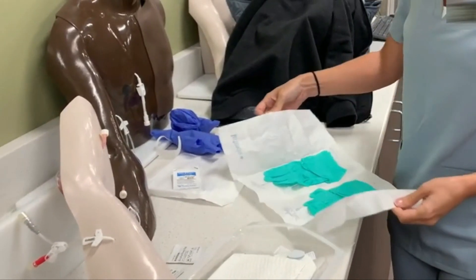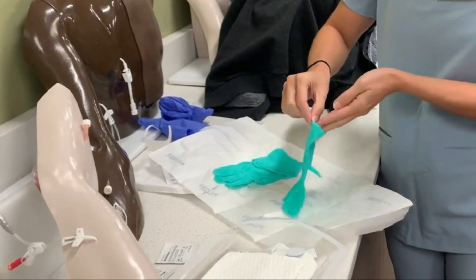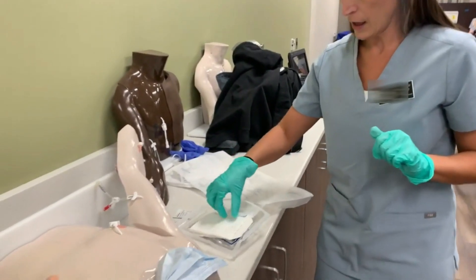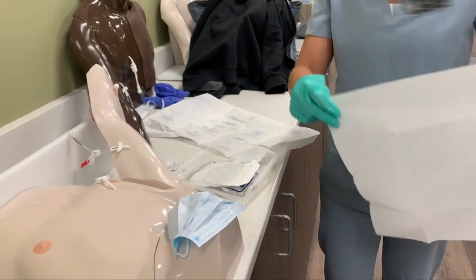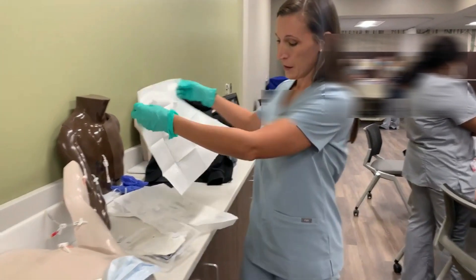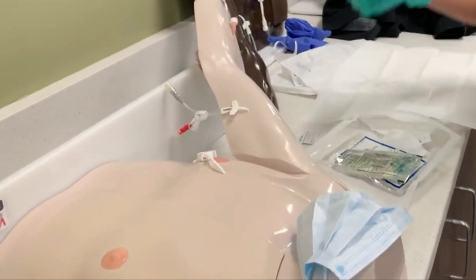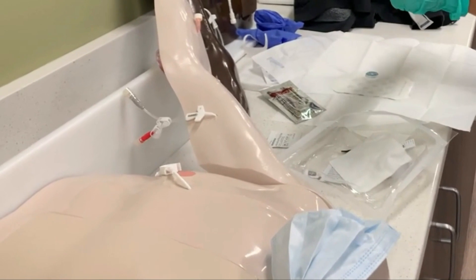Remember your sterile glove technique, because you'll be doing the same thing here. Now you have a sterile drape, which can be useful to make your sterile table. You can put it on your patient's chest, but it usually will just fall off, so I just set it aside. Remember your gloves are sterile — you want to keep them as clean as possible. The kit contains a dressing bio patch, iodine swabs which we will not use, and alcohol swabs — go ahead and tear those open.